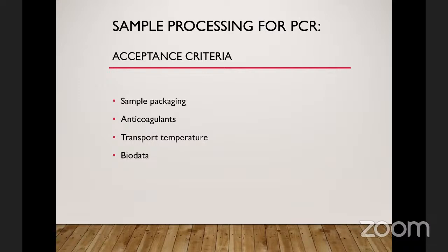So the next thing is the biodata. Like I've also earlier said, most of the investigations we do or most of the testing we do with PCR are things that could cause a lot of legal issues. For instance, a sample is coming into your lab for paternity dispute resolution, and then in the molecular lab, there's a part where you have to do some form of amplification.